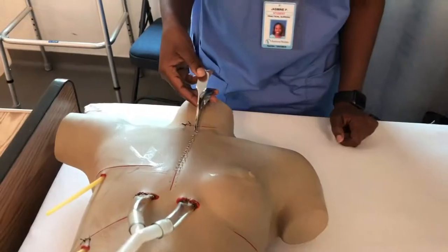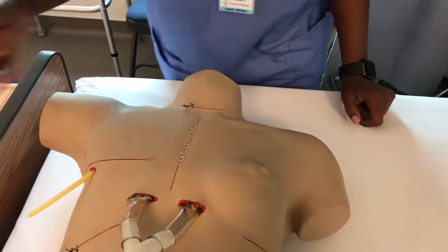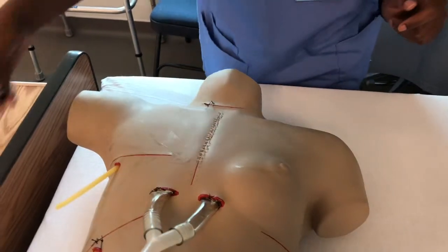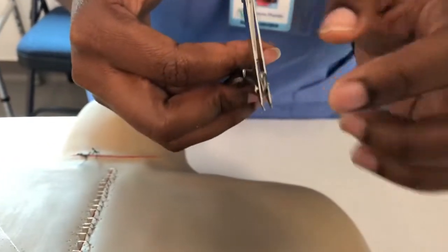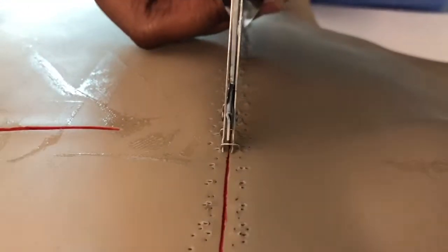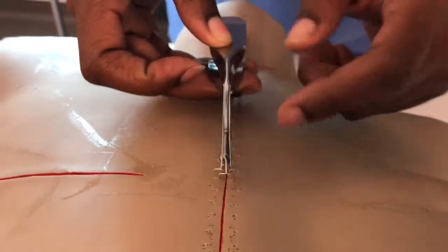This one doubled up — so you do every other. You should do every other. This is the bottom, this is the top. So you put the bottom prongs underneath, like this, and push. Try to have it in the middle and steady, and it'll open up.